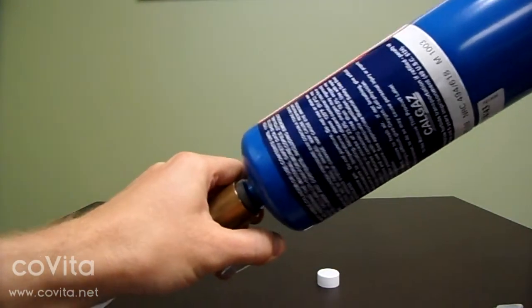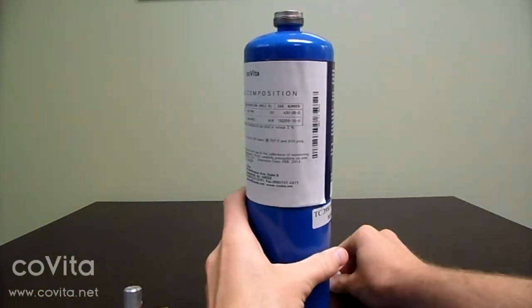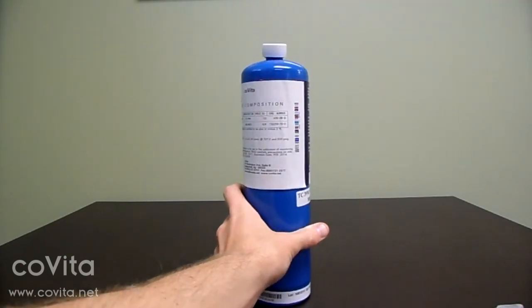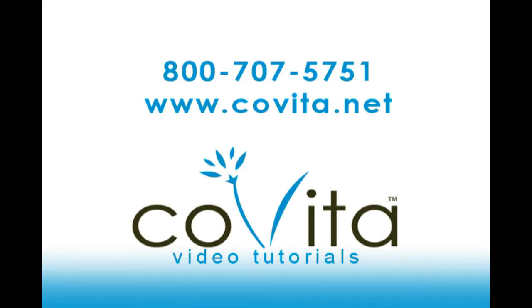Finally, replace the dust cap to the top of the can and store your calibration kit in its original packaging in a temperature-controlled environment. Your calibration is now complete and you are now able to conduct a test or turn your monitor off if no further readings are necessary.